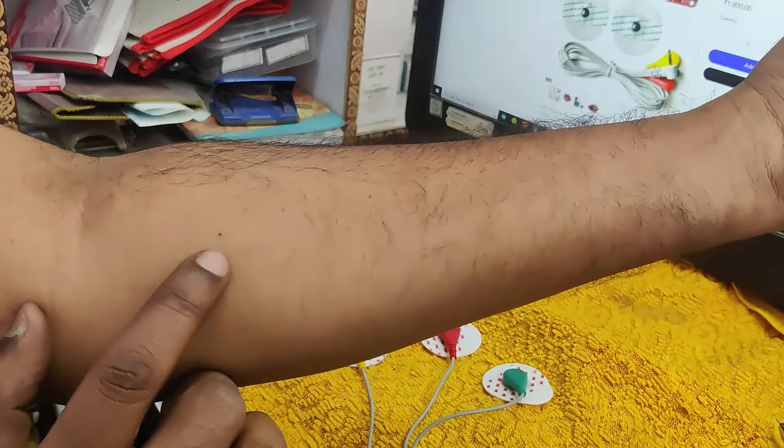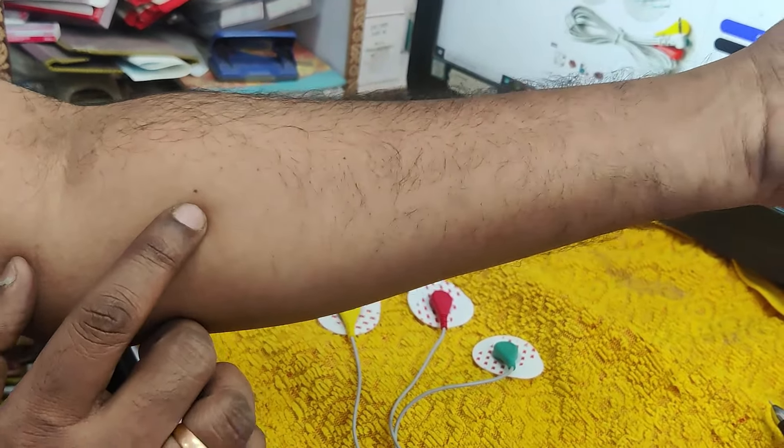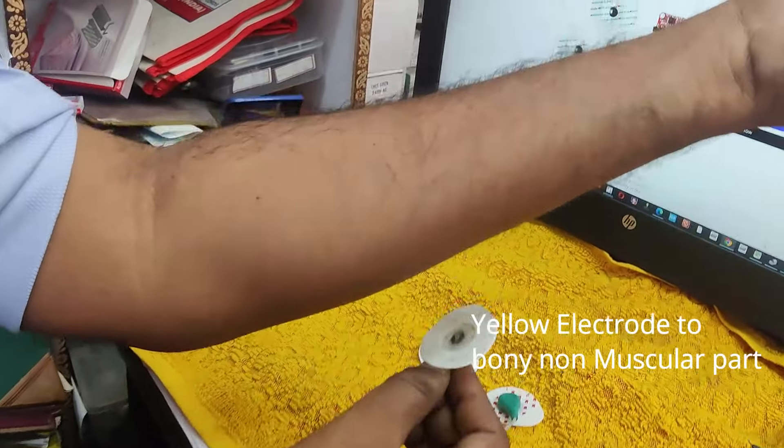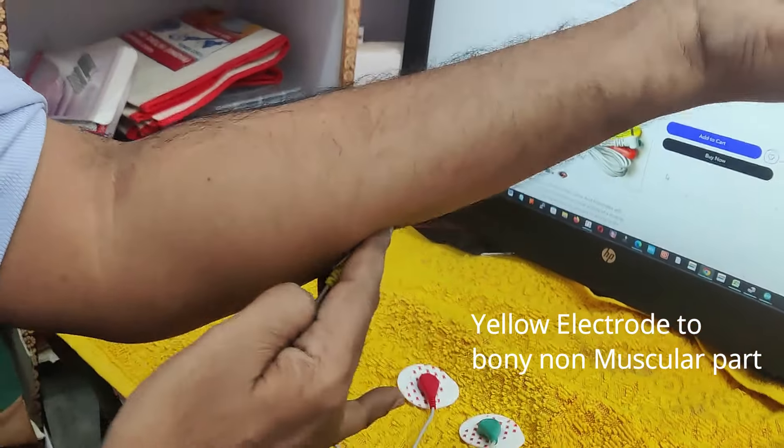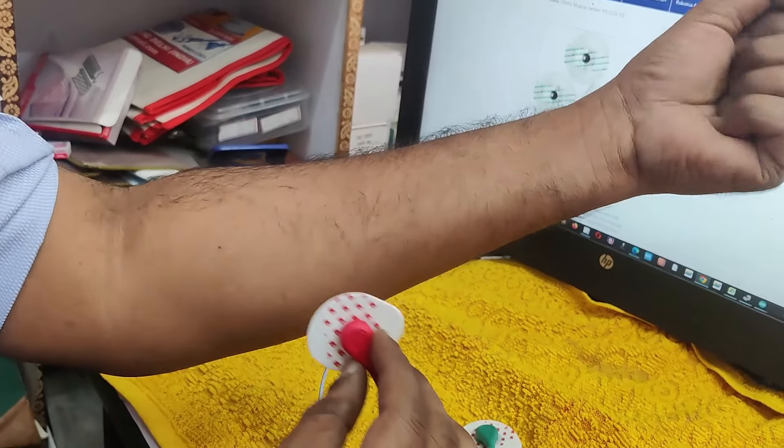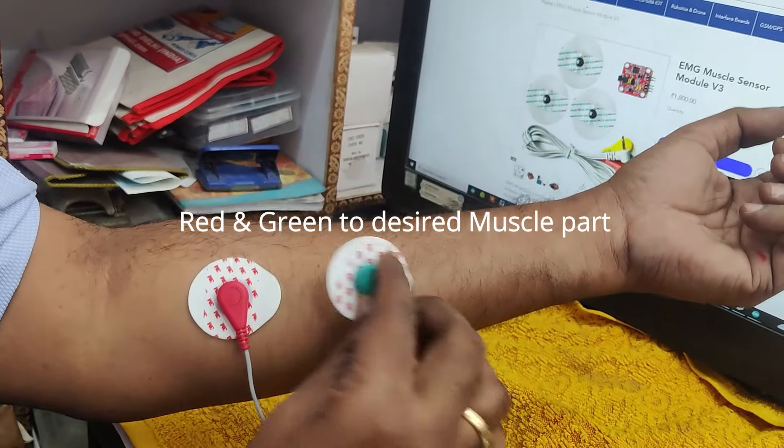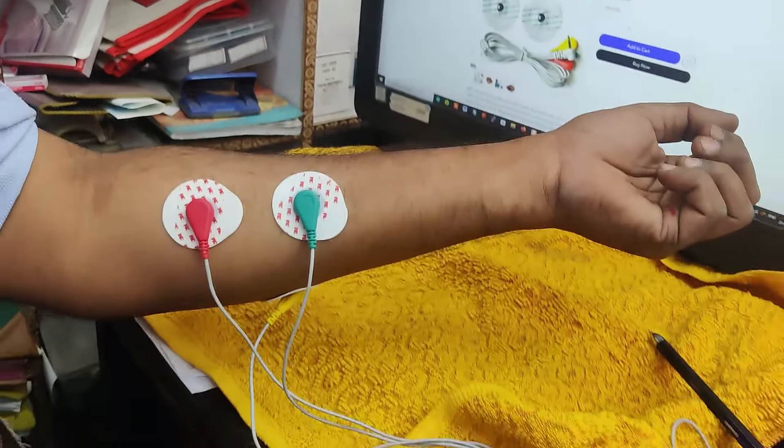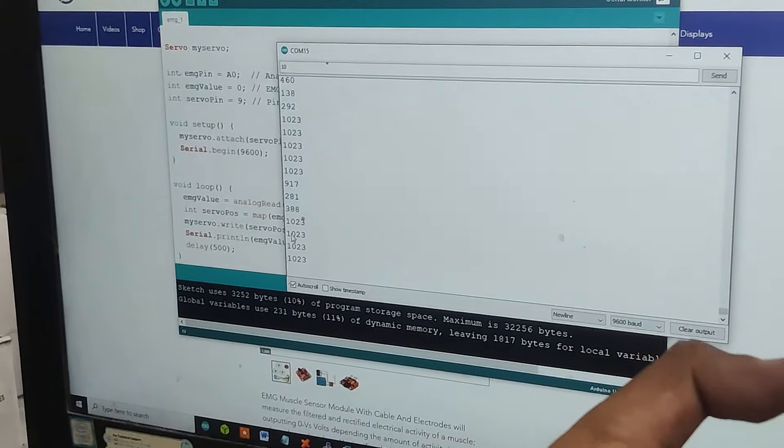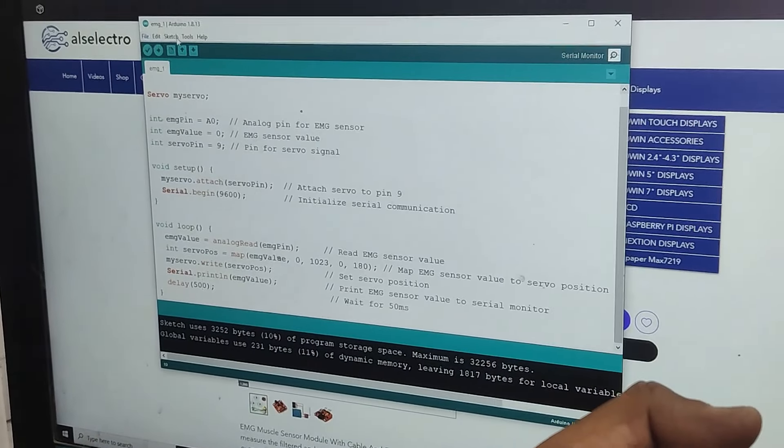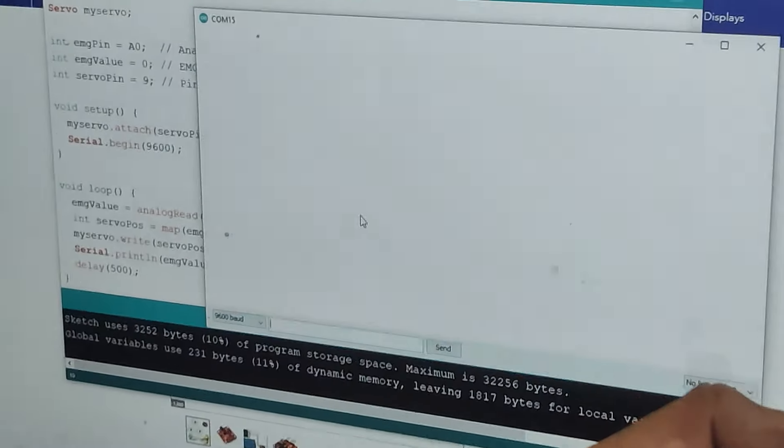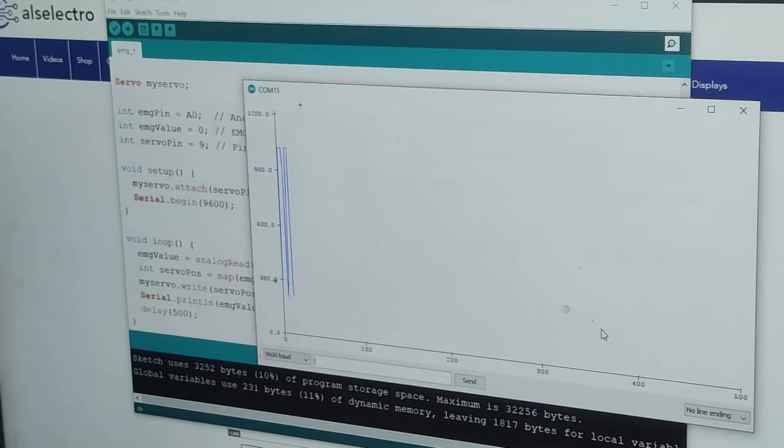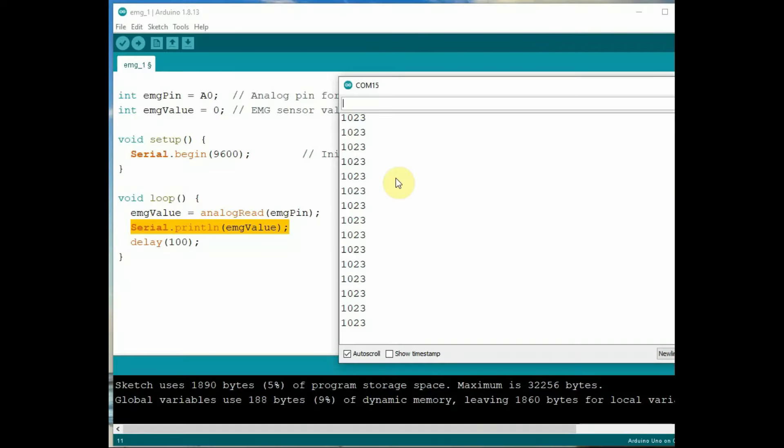Now let us connect the electrodes to the muscle part. First is the yellow electrode that is connected to the bony non-muscle part near the desired muscle and then the red and green to the desired muscle parts. This is how we have to connect. Yellow always a support electrode. Now you can see the value change and the serial plot in the Arduino serial monitor.